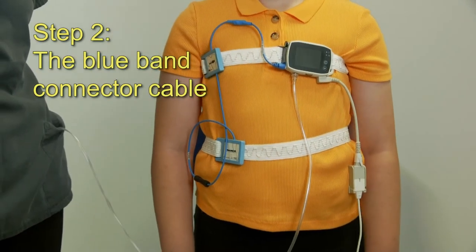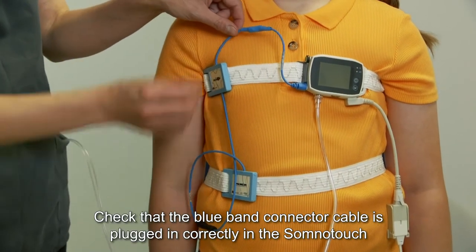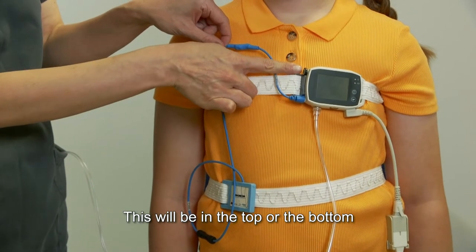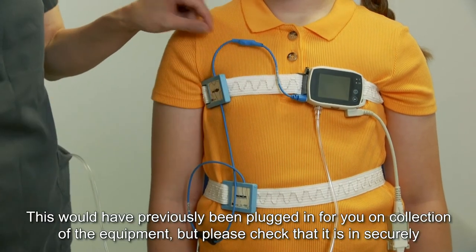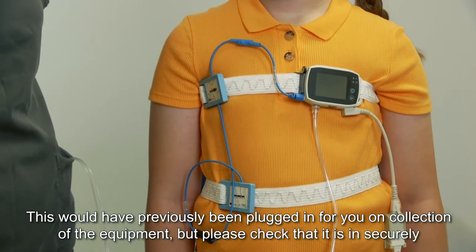Step two: the blue band connector cable. Check that the blue connector cable is plugged in correctly to the SomnoTouch — this would be in the top or the bottom. This would have previously been plugged in for you on collection of the equipment, but please check that it is in securely.